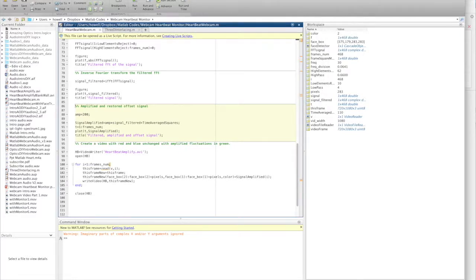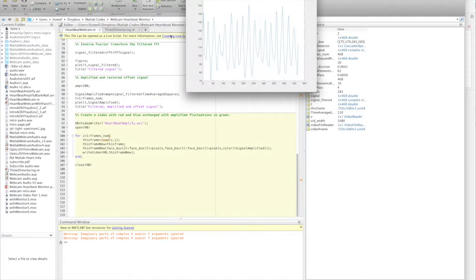In this section, we take the filtered signal, amplify it, and add the time average signal back on. This gives us the same average value as before, but the fluctuations associated with the heartbeat are much larger now. You can see that we have larger fluctuations centered around our average value.